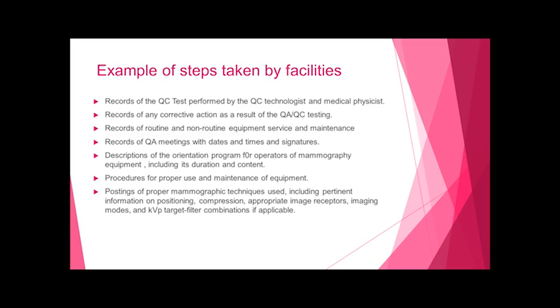Records of routine and non-routine equipment services like PMs, maintenance, and checking the output rate, and so on. Records of QA meetings with dates and times. They want signatures. You don't have to, but they would like it.